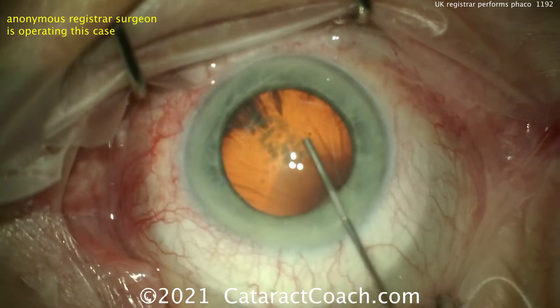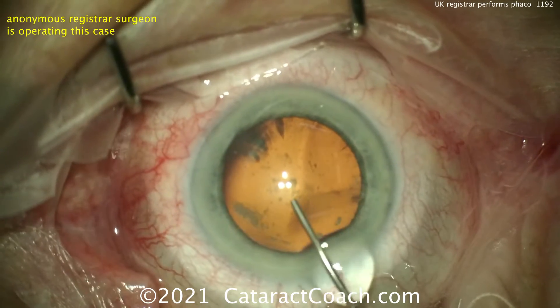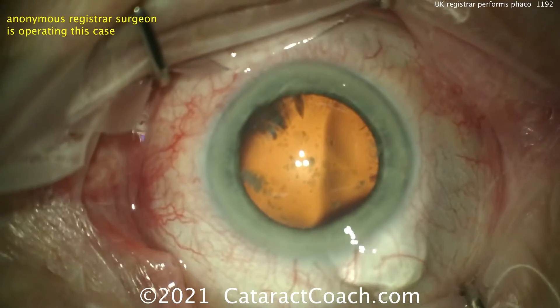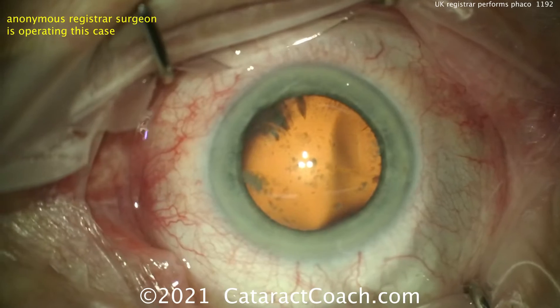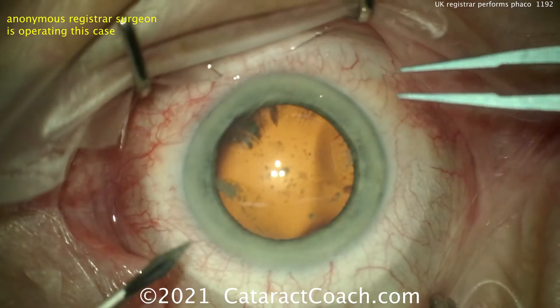Now this is probably our viscoelastic. What's interesting was that the main incision was placed in an eye without viscoelastic, just with the normal aqueous. That certainly requires a little bit of skill because the eye can collapse.